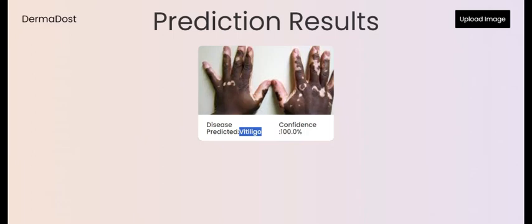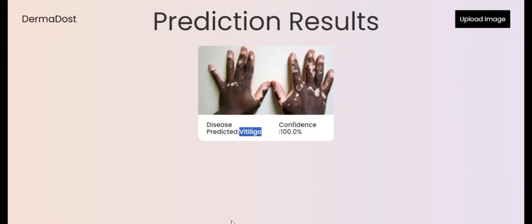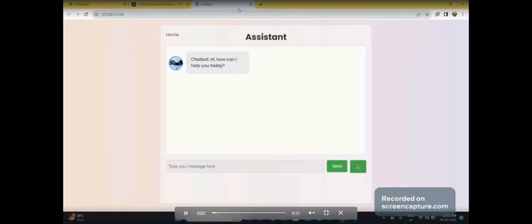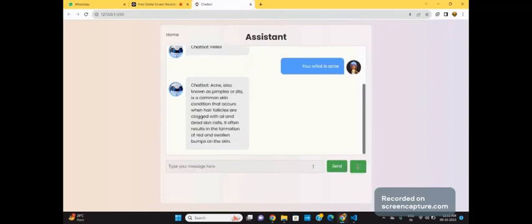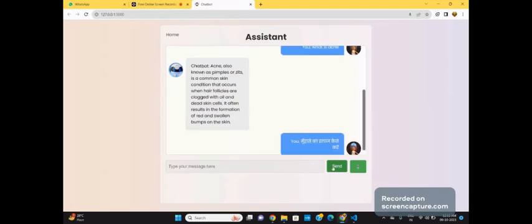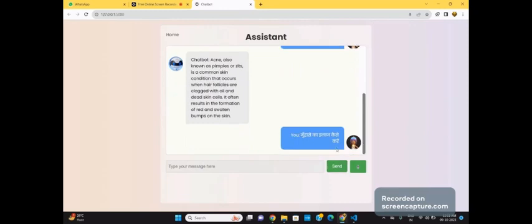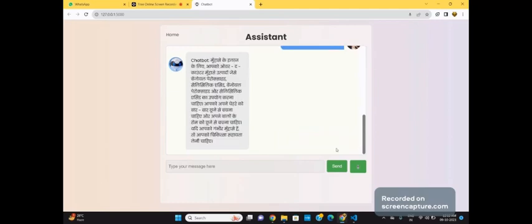Now let's have a look at the chatbot provided along with the application. It has voice recognition — for example, asking 'What is acne?' gives correct results. One more helpful feature is that it is able to detect 30 plus languages. For example, if I ask a query in Hindi, it will give the answer in Hindi as well.